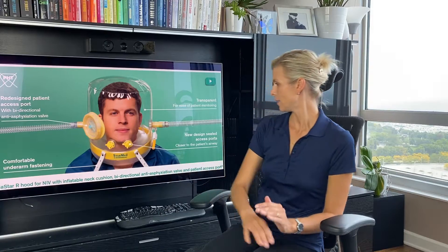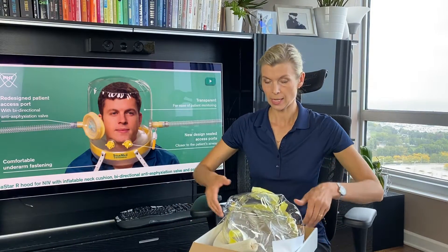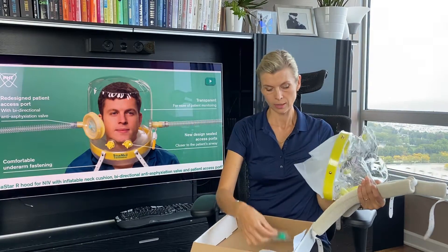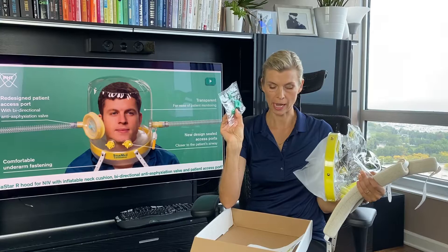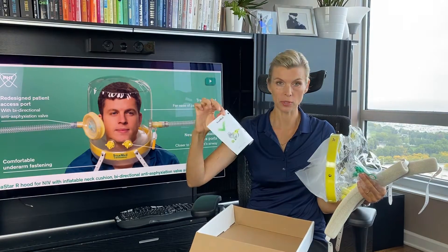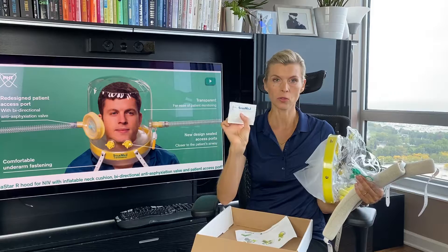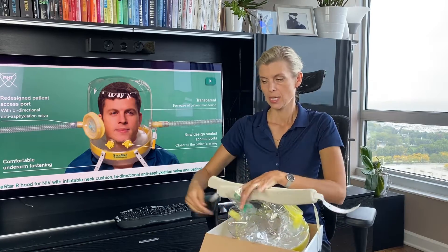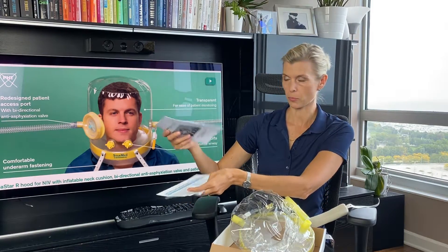This is how the helmet looks from StarMet. You will receive a box with the helmet itself — it's a one-piece helmet — underarm straps, an access port with a smaller diameter opening, instructions on how to use the access port, a measuring tape so you can choose the correct size for your patient, fact sheets for patients and healthcare providers, and a booklet on how to start NIV for patients using the StarMet helmet.